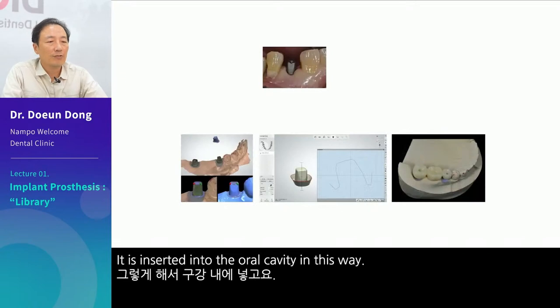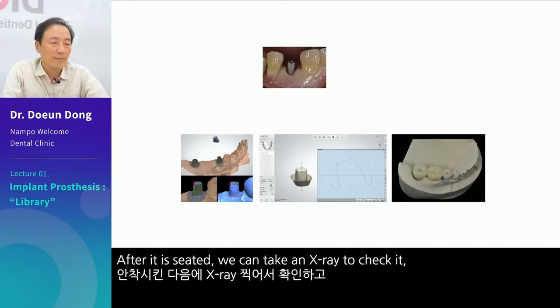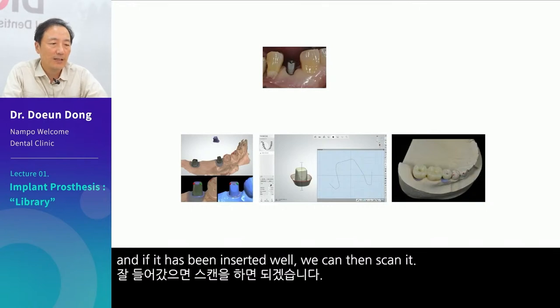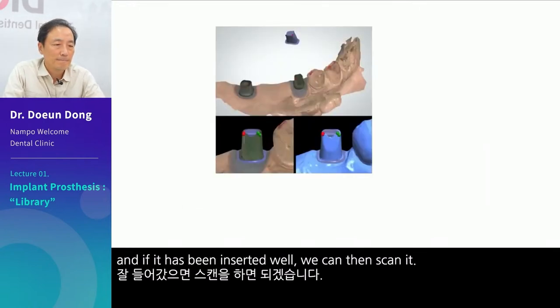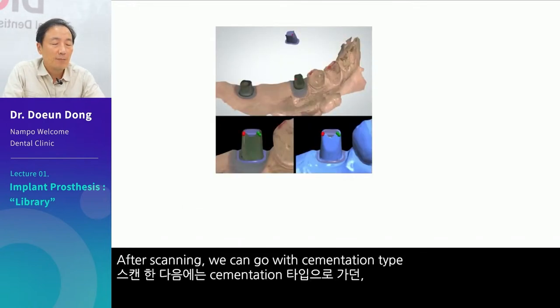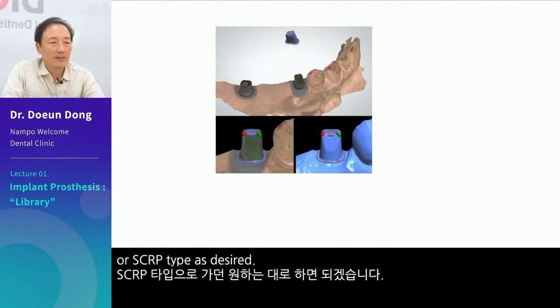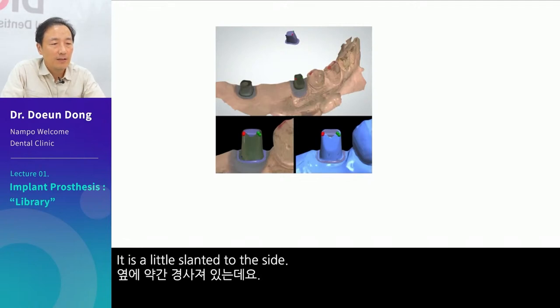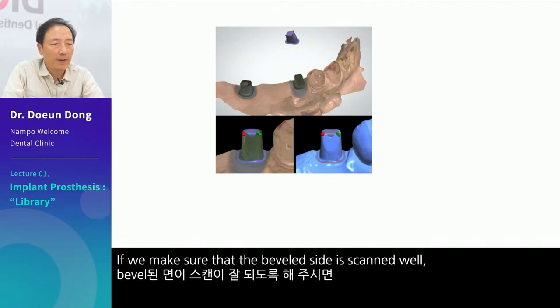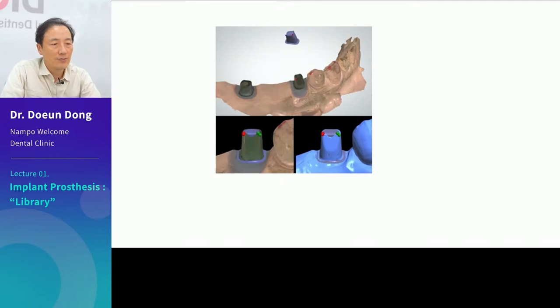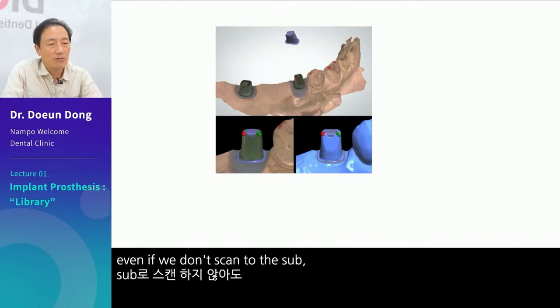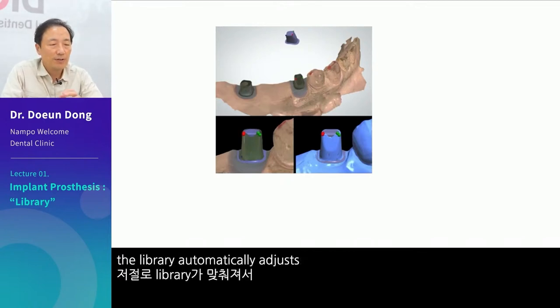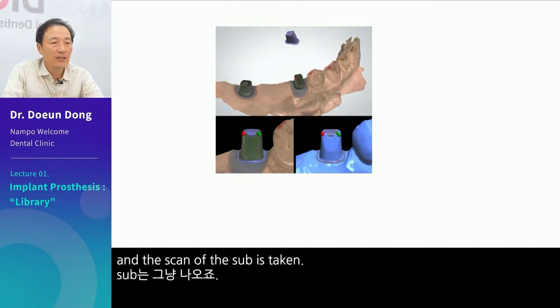It is inserted into the oral cavity in this way. After it is seated, we take an x-ray to check it, and if it has been inserted well, we can then scan it. After scanning, we can go with cementation type or SCRP type as desired. It is a little slanted to the side. If we make sure that the beveled side is scanned well, even if we don't scan to the sub, the library automatically adjusts and the scan of the sub is taken.